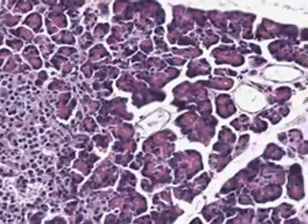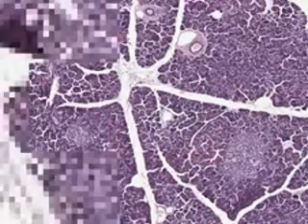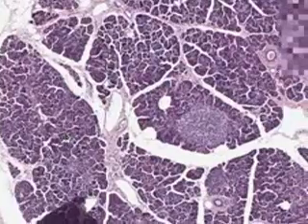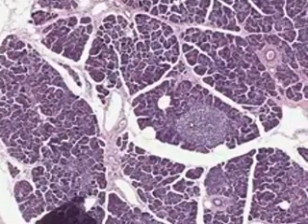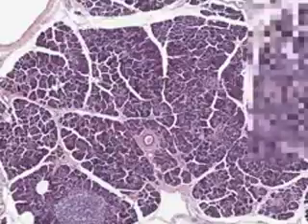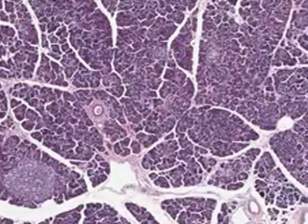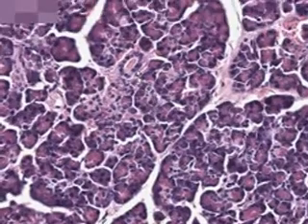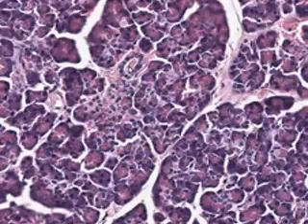Let's find an intralobular duct. And to do that, let's back up rather than waste our time. I think we could probably, oh, look at that beautiful islet right there. Look how well defined that is. Look at all the acini around it with the zymogen granules and some centroacinar cells. And I think this critter here could probably qualify as a beautiful intralobular duct because it's entirely lined by epithelium. There's not any significant amount of connective tissue in it, and it's surrounded by acini.